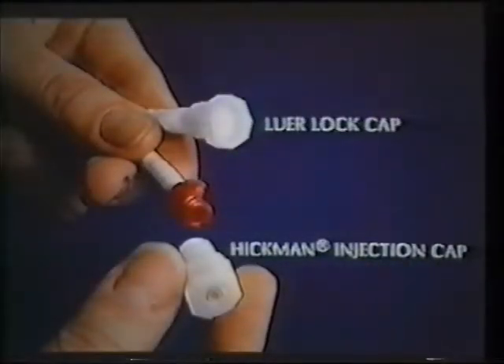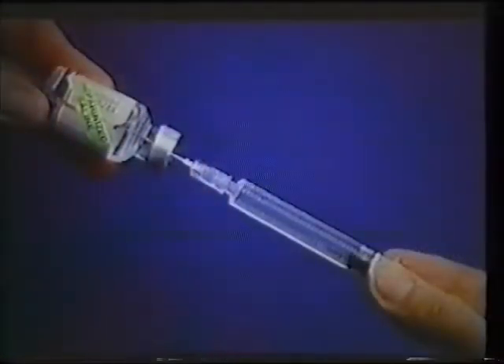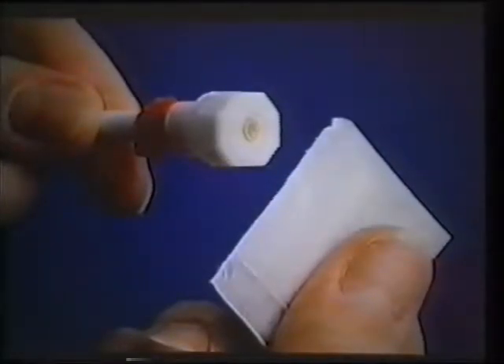Hickman injection caps are supplied with each Hickman and Broviac catheter. The catheter should be irrigated through an injection cap. If the catheter does not have an injection cap in place, clamp the catheter and remove any locking cap or other connector, then replace it with an injection cap. Using sterile procedure, withdraw 3 milliliters of sterile heparinized saline solution into the syringe. Recap the needle and set aside. You may also use pre-filled, pre-packaged syringes of heparinized saline. Thoroughly clean the injection cap with an alcohol wipe or a povidone iodine prep swab.